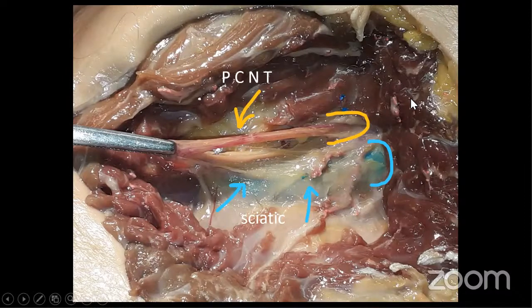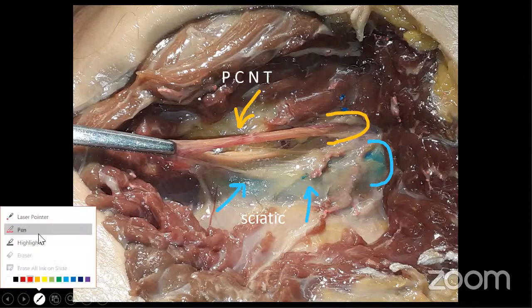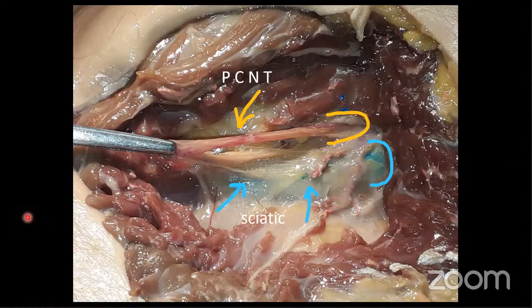I have given already latex by ultrasound, blue latex, which you will see here, a bluish discoloration below the sheath. So this posterior cutaneous nerve of thigh has got a separate sheath from this. And when I dissect this, you will then see that this is a separate tunnel for the posterior cutaneous nerve. So it is still on the proximal side, on this side, where you will find the sacral plexus, as already been mentioned here. So that is the one which blocks the posterior cutaneous nerve.